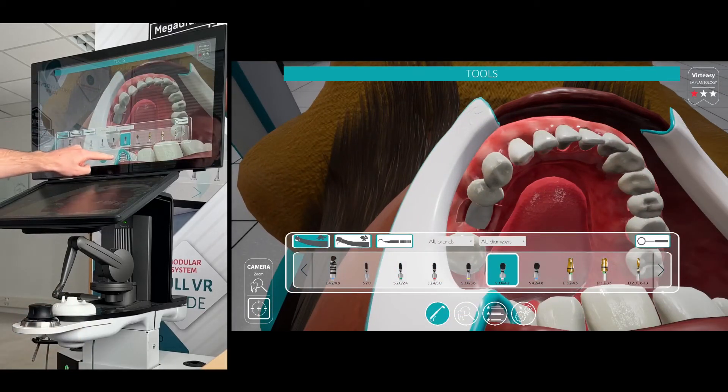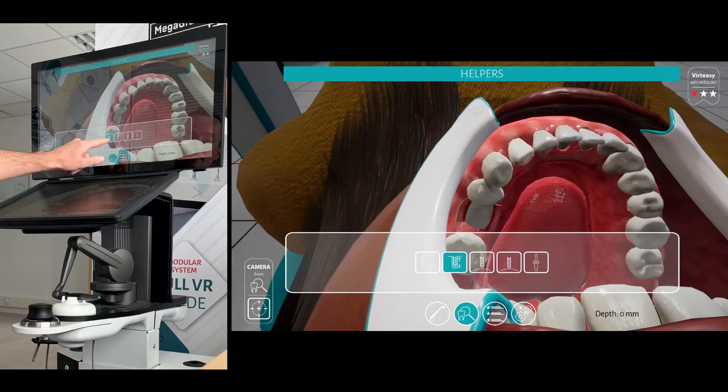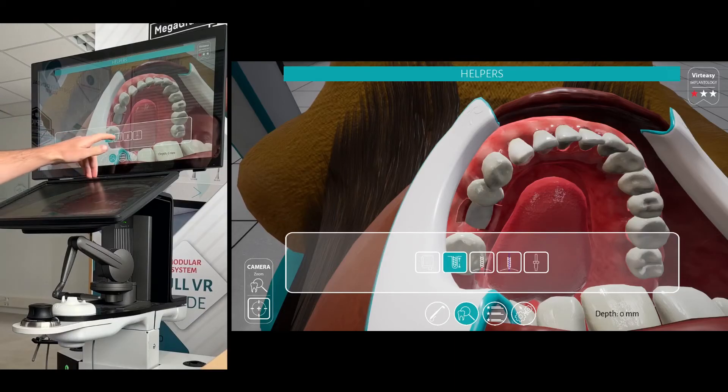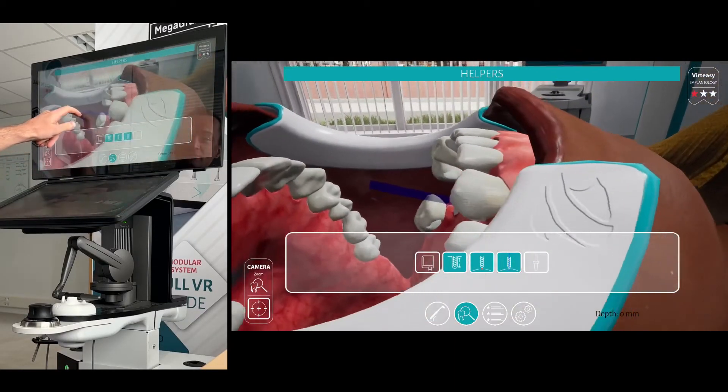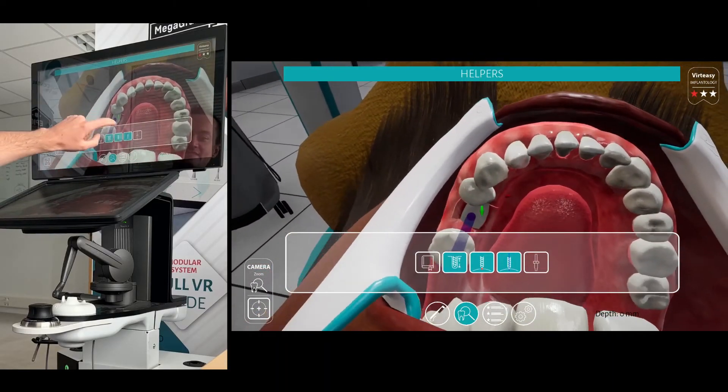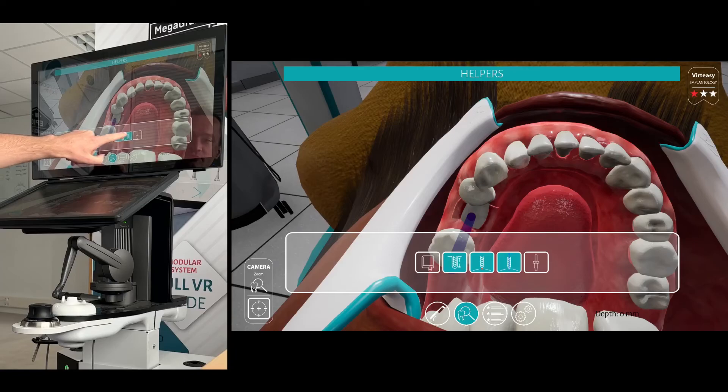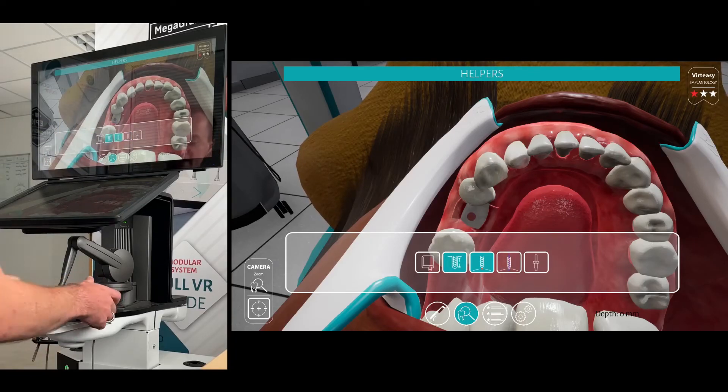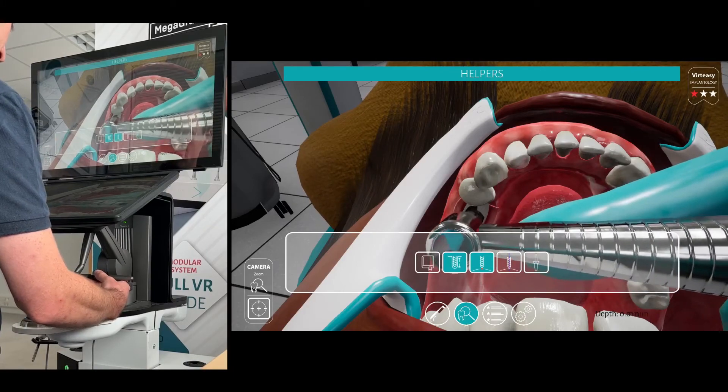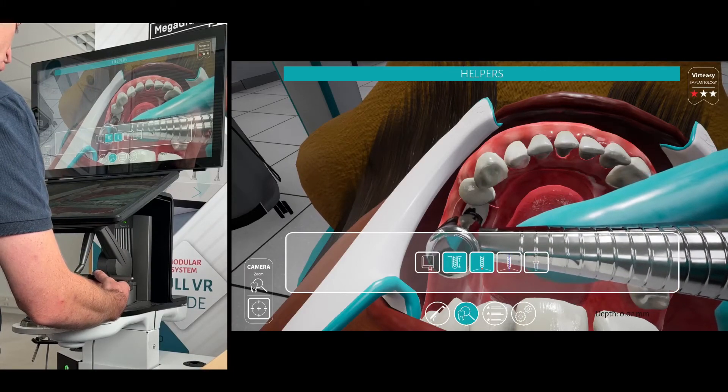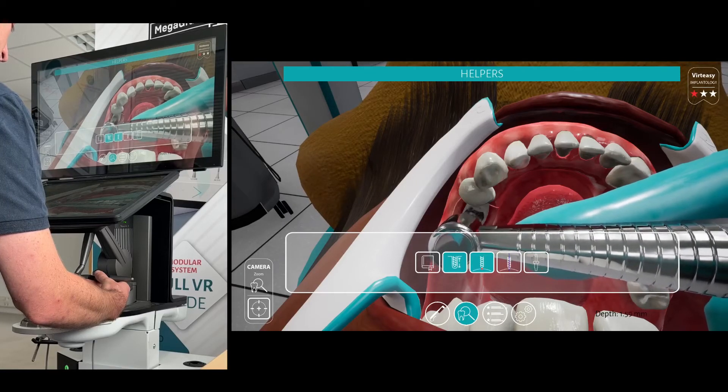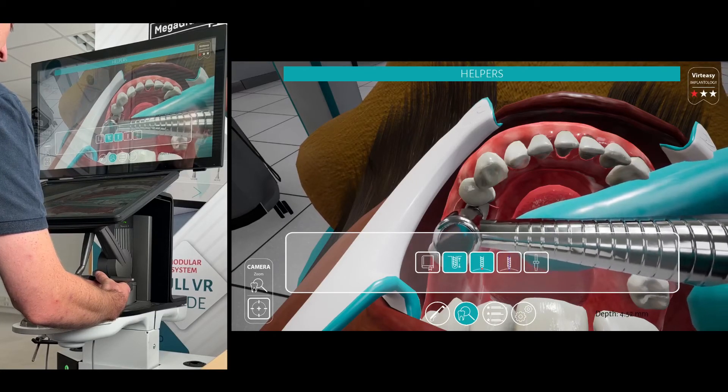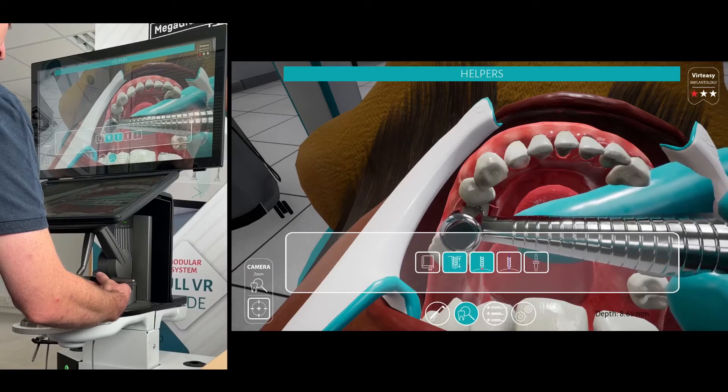And on this second menu we have a lot more helpers. So I have the depth gauge so I can see the depth that I'm drilling at, the point of impact and the axis based on my planning. And then this visual gauge that we're going to use after we do the drill. So I'm just going to keep the point of impact there. I use the bottom screen and I'm going to go straight in with a large implant drill just so I can hopefully show you that gauge after we do it. And I'm going to go all the way through. So I'm going to create a perforation there.